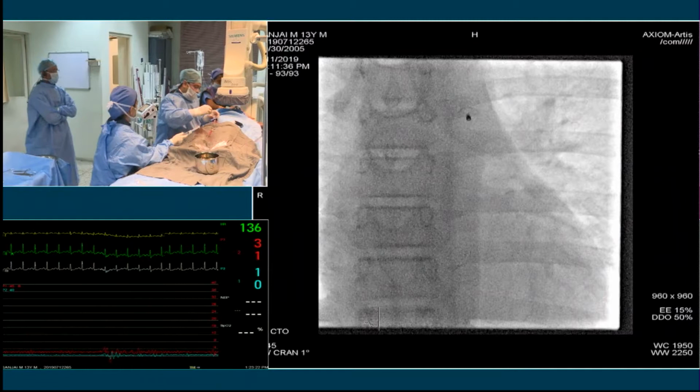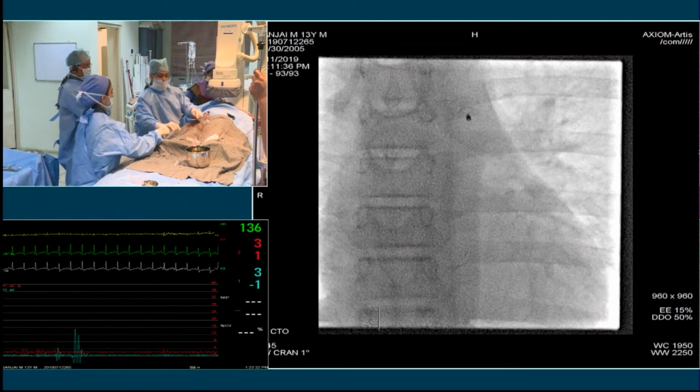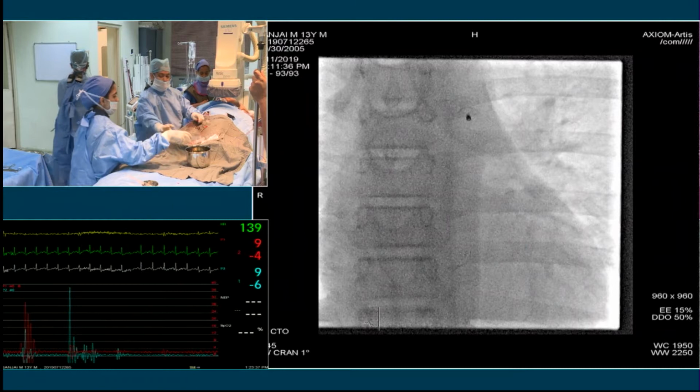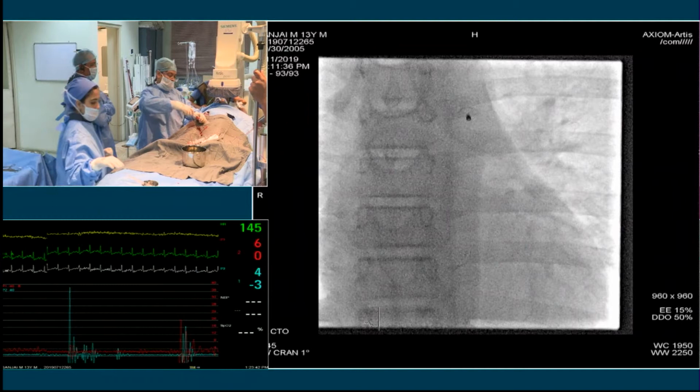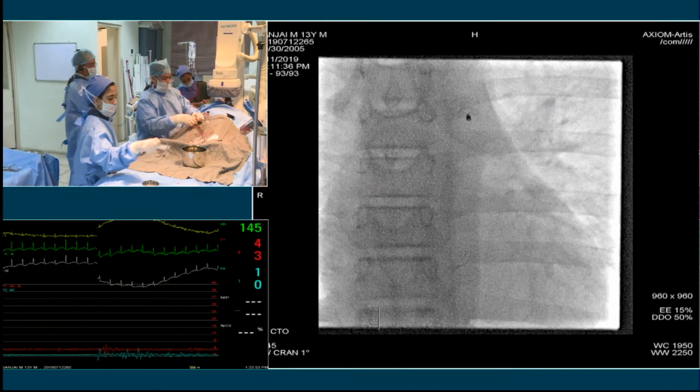This is reverse sizing. So 8, okay, on the pigtail I'm taking. What we look for in the PDA closure is that the shaft is dented. If it is accurately positioned, the shaft is dented. That denting suggests that the device is not likely to embolize. But there may be a false impression, because the device is naturally indented. So how will you know whether it is really indented or not? That's the issue. Mm-hmm. It's a valid point.